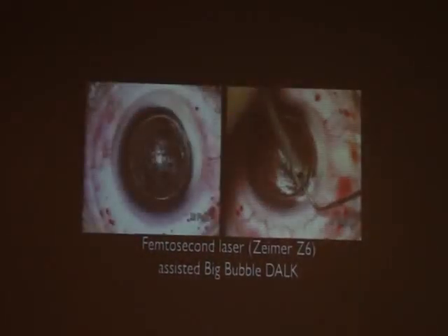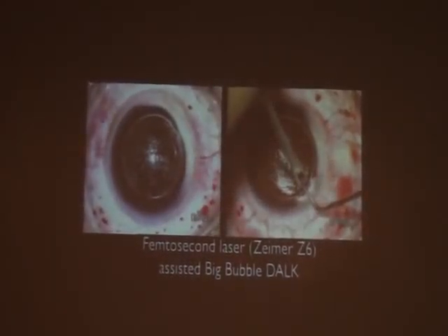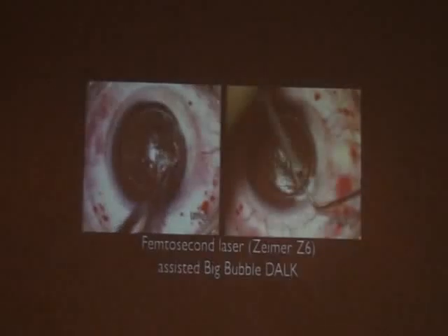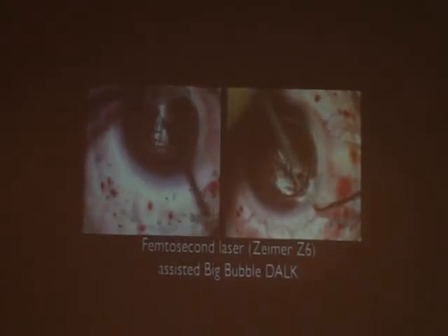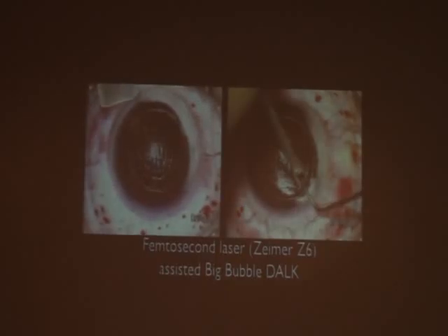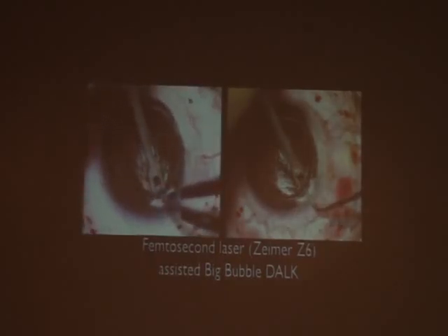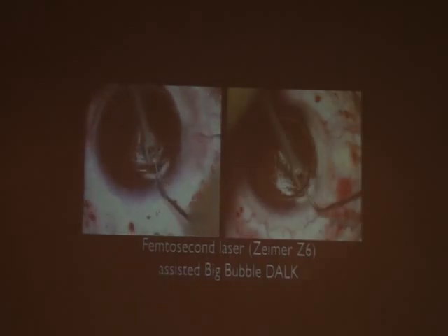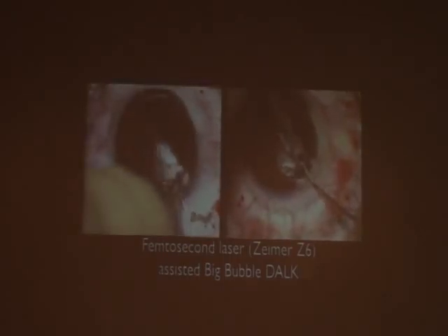So in a keratoconus patient with eczema, we have done a vertical cut and also a horizontal cut. The horizontal cut is about 300 microns, and then you can see that the anterior lamella can just be peeled off. The vertical cut goes to about 450, so you have a peripheral cut that's going 150 microns deeper. So you go to the periphery and catch with your stromal fixation forceps, make that small pocket, introduce the cannula, and once it is in plane, you can inject.